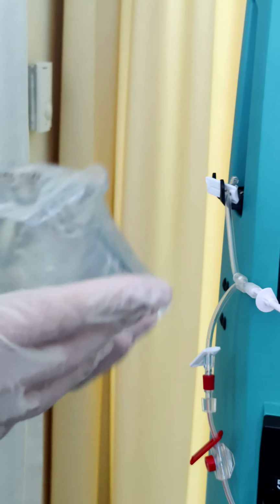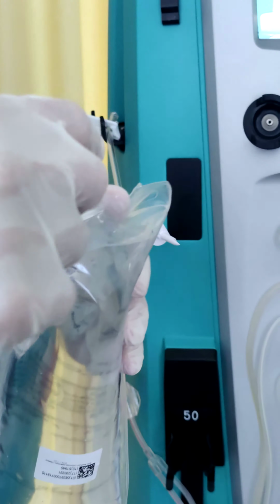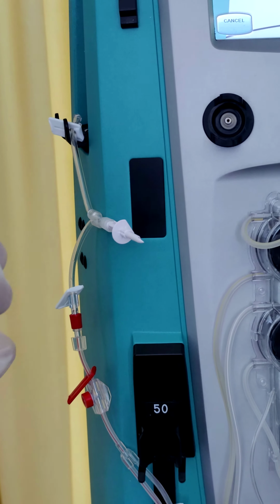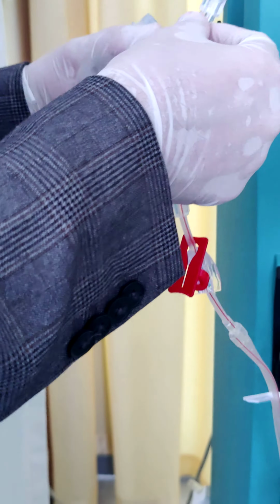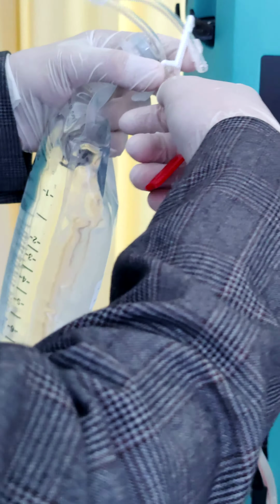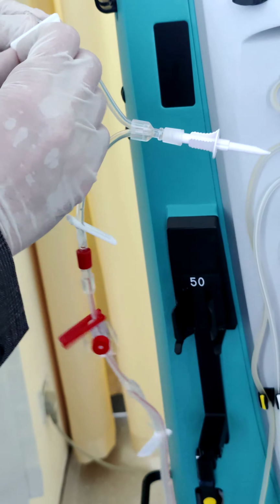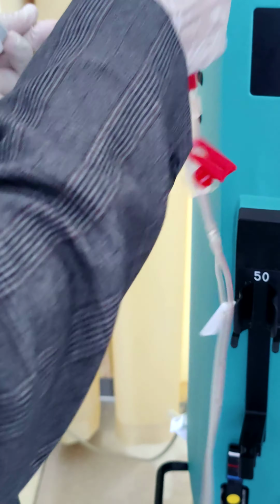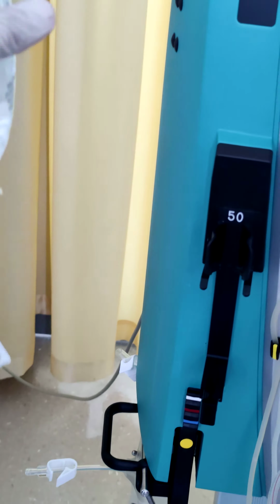Before connecting, what do we have to do? Heparinize. Yes, 5,000 international units, we can add it. Okay, let us clamp it now and I will see this one. I think it was in the other line. So we'll see. Okay, just attach it here. That will be with the yellow.